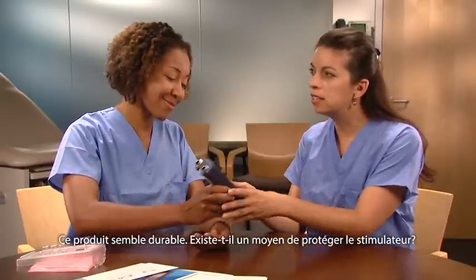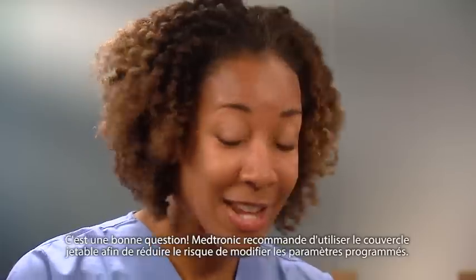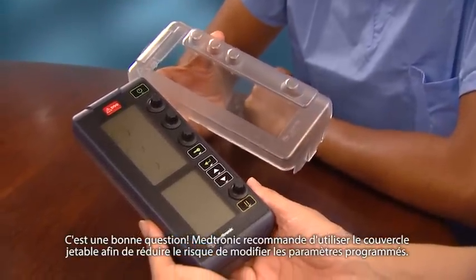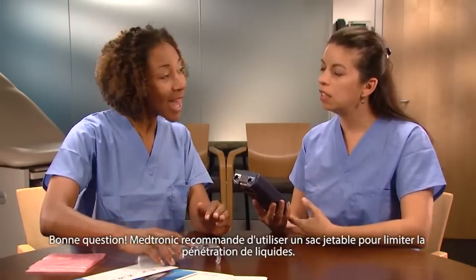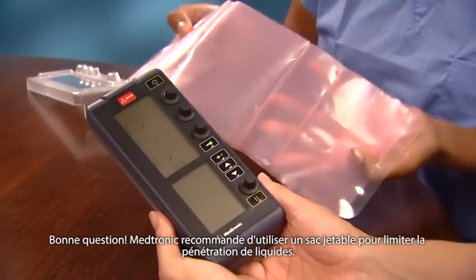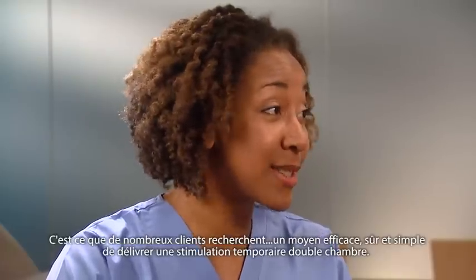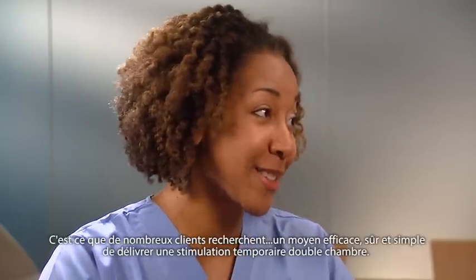Is there anything that helps protect the device? Medtronic recommends using the disposable cover to reduce the risk of tampering with program parameters. What about a cover to keep it clean? Medtronic recommends using a disposable pouch to minimize fluid incursion. It's what many customers have been asking for — a safe, easy, and effective way to deliver temporary dual chamber pacing.